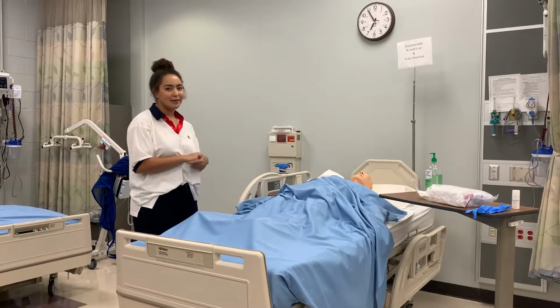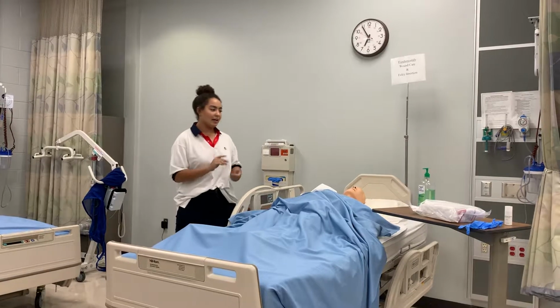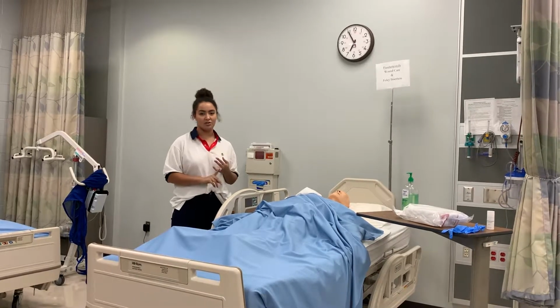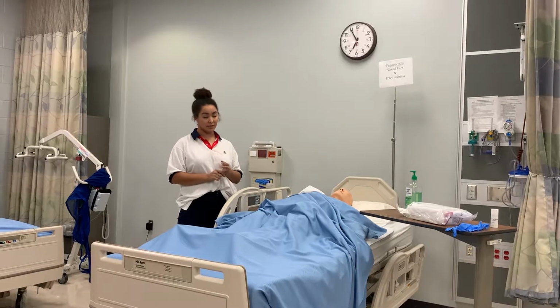All right, so we are going to be performing a Foley catheter on Mr. Fundamental. I checked my provider order and it is correct. I verified my patient, I introduced myself, I performed hand hygiene while entering his room, and I provided him privacy.